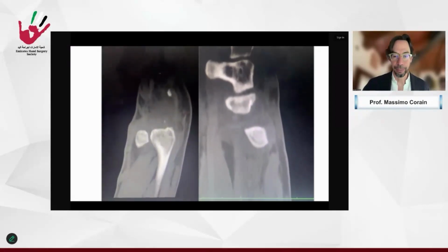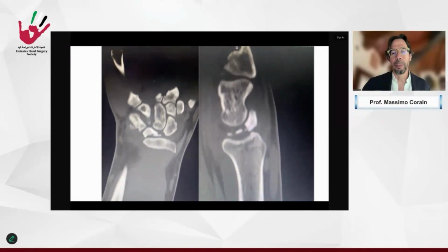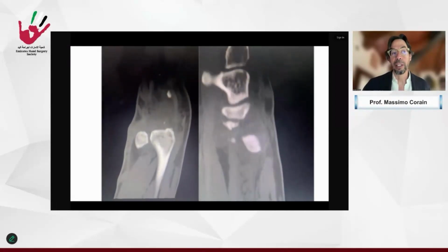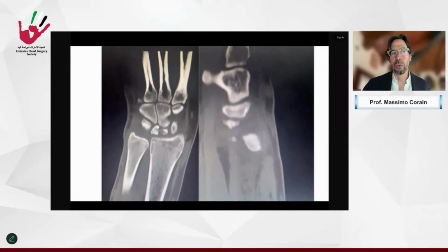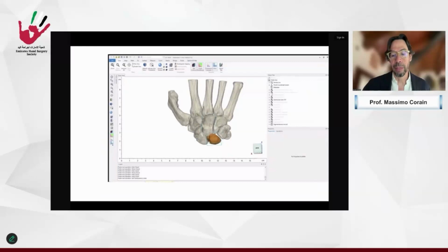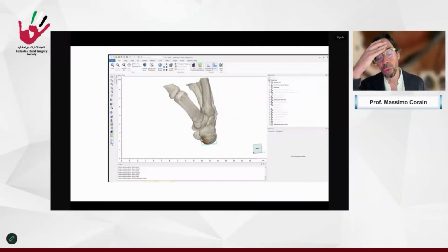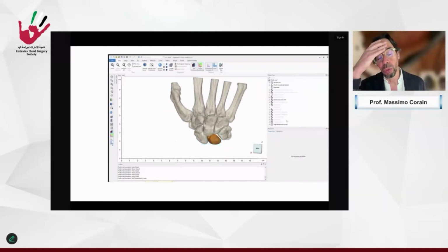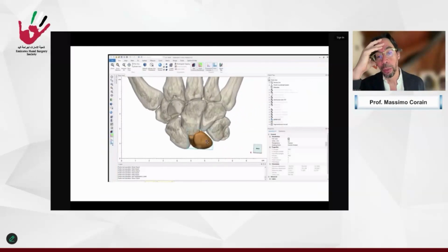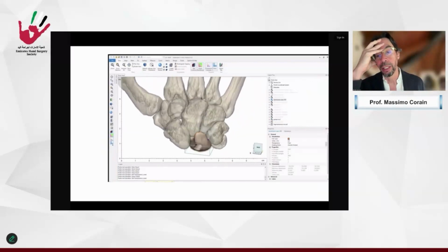This patient was 22, 23 years old, so I decided on either a proximal row carpectomy or to try to use a lunate prosthesis. I had experience of 12, 13 cases with lunate prosthesis in pyrocarbon, not custom-made, but I tried in these cases a custom-made one. So with the engineer, we decided to design it. The problem was how to fix the lunate to the scaphoid and triquetrum, and it is an actual problem for a surgeon approaching this kind of surgery, which is not easy. And I thought about 2 ways to fix it.